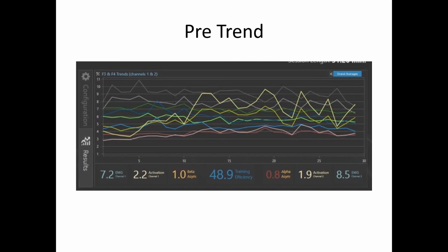If delta's down, what's going to get that delta up? If beta's too high, what's going to get that down? So we have an expert system based on decades of neurofeedback research and clinical experience from our New Mind group that says these protocols tend to rectify this harmonic imbalance at these locations. Will it always? No, the complexity level is too high. We can only say probably. It's just like quantum mechanics. When the wave function collapses, we can only tell you probably what the quark relationships are going to be. We can't predict accurately. We can only give you a range of probability.